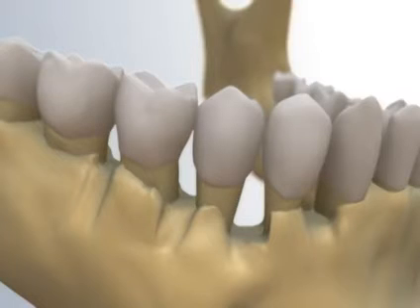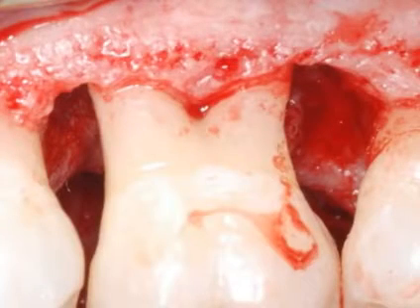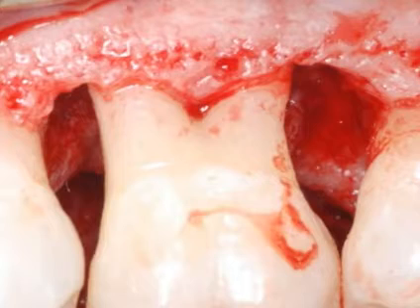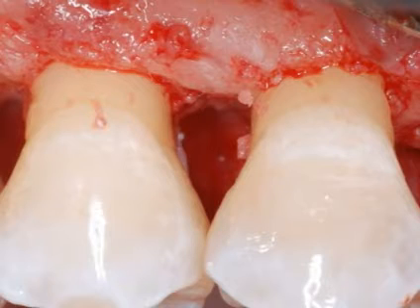Indications for this step include one-walled interproximal defects or hemiseptal defects. For large defects, achieving positive architecture may require too much bone removal, thereby compromising the periodontal support of the tooth. In these cases, a compromised osseous architecture, such as flat architecture, is acceptable.